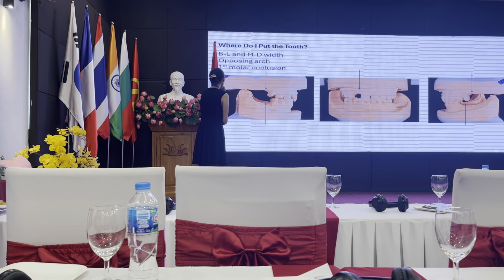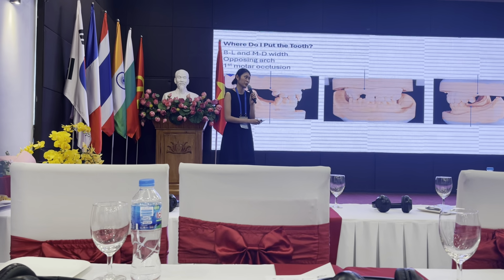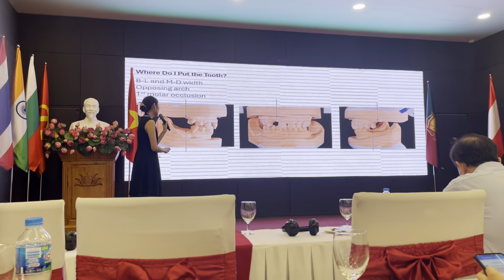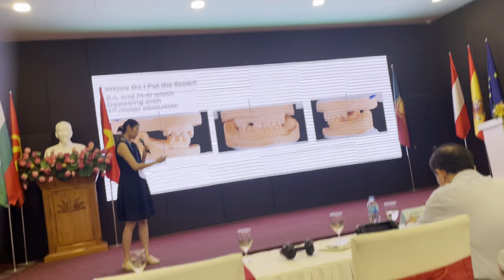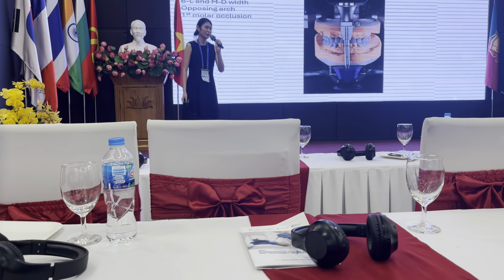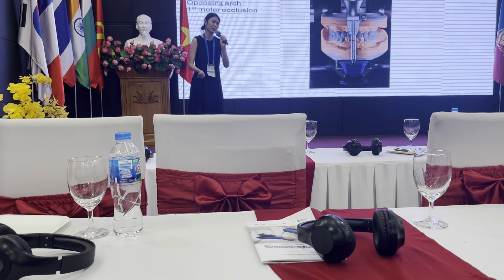And also you want to consider the opposing arch, because during treatment we need to consider the position of the teeth in the opposing arch, and the position of the molars, the first molar, too.